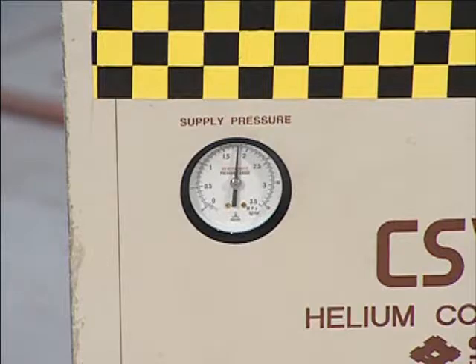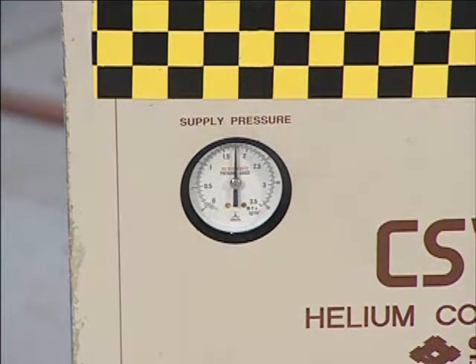Before removing the charging equipment, make sure that the system has resumed its normal operation. When satisfied that the charge process is complete and operating within spec, remove the charging equipment.